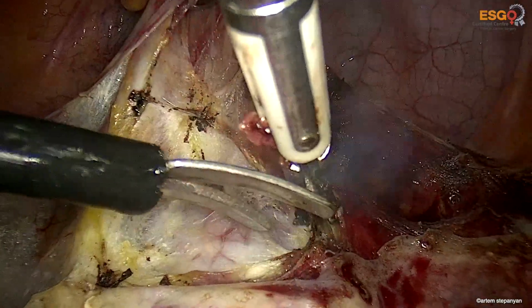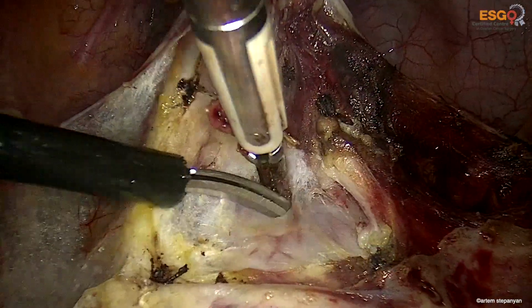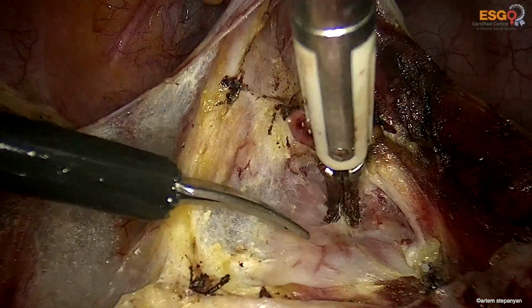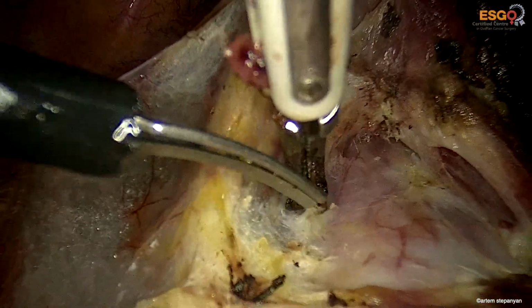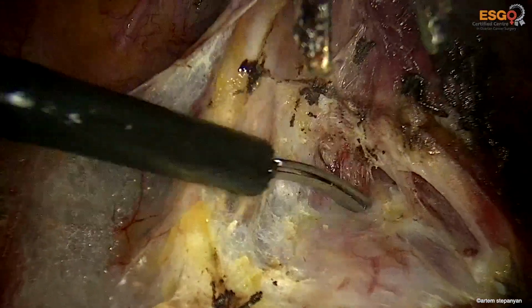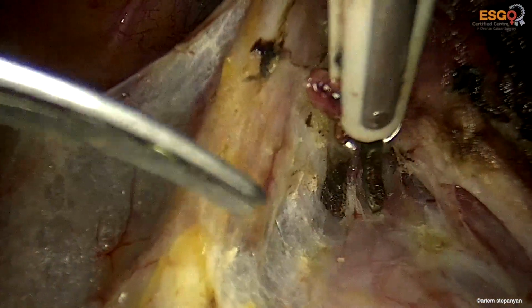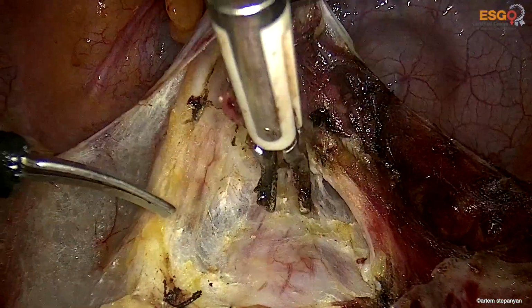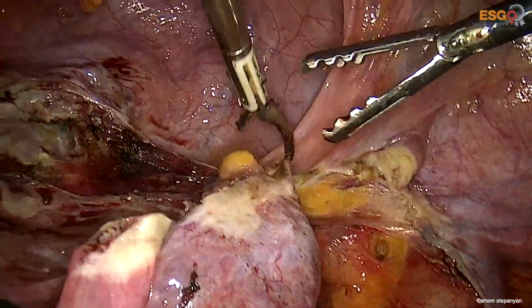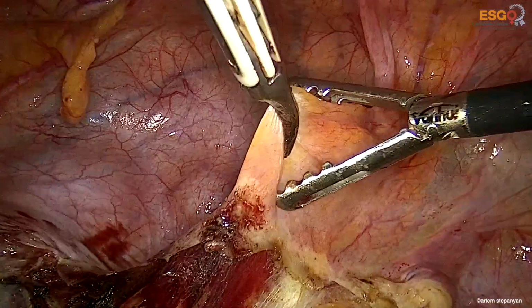You'll find the pubocervical fascia, which is our landmark, and then we detach the detrusor muscle from the anterior vagina across the pubocervical fascia in relatively bloodless cleavage plane.